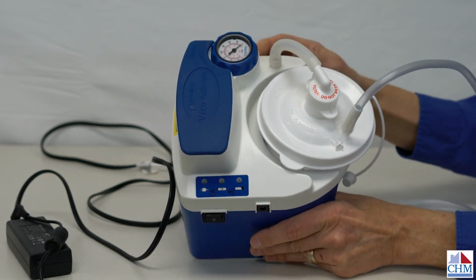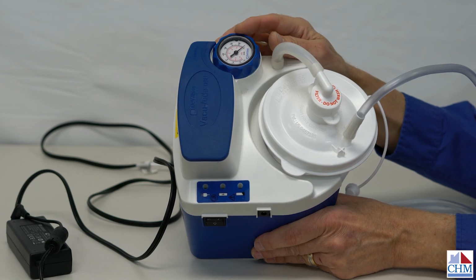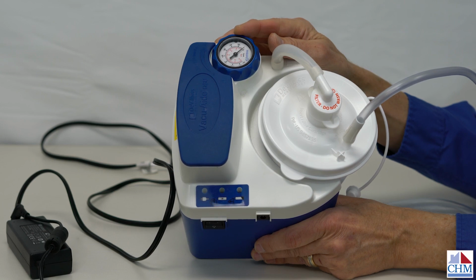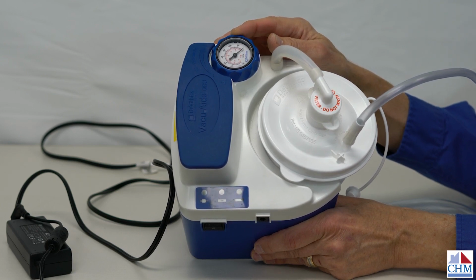Also, while I've got it tipped up, you'll notice that there is a vacuum pressure gauge here. So this is very important. This measures vacuum pressure, so it's negative numbers. And for trach suctioning, what we're shooting for is a suction pressure of about 150 millimeters of mercury. The reason we limit that to 150, even though the machine will go up to about 600 millimeters of mercury, is that we want to be careful with suctioning into the airway to make sure that we're not damaging tissue when we put that catheter in there.